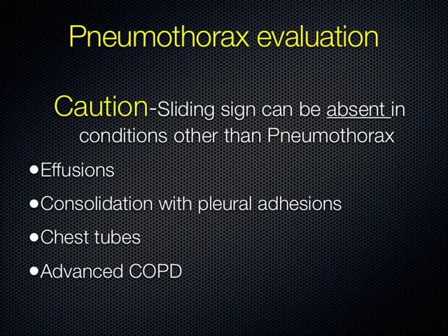make a decision, because if a patient has a chest tube in, for instance, that's tacking down their lung, it won't slide when they're breathing. Or if they have a bleb or adhesions from a prior infection or anything like that, sometimes the lung does not slide normally.